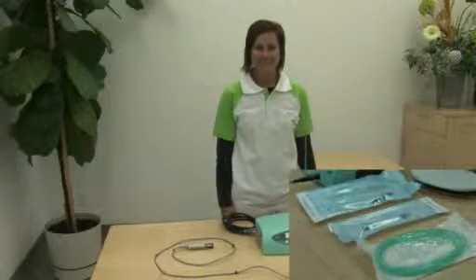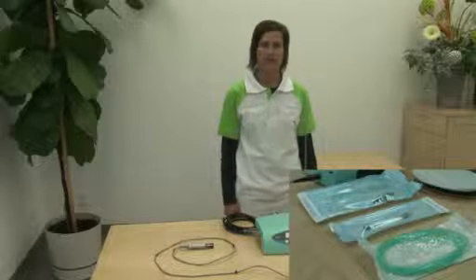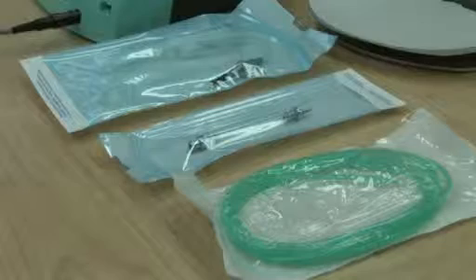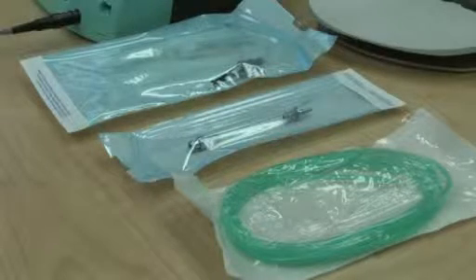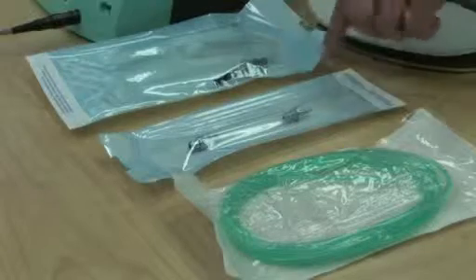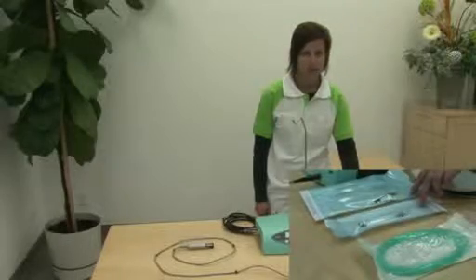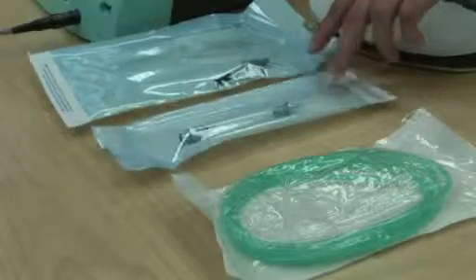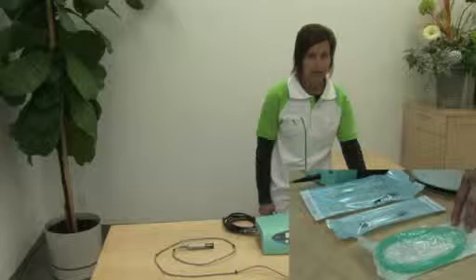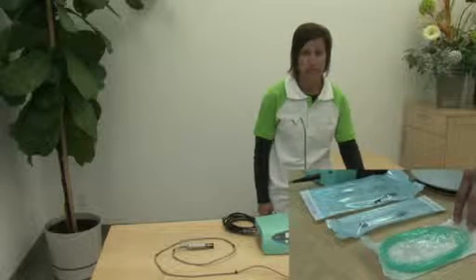Hi, it's Carly with W&H again. In this session I'm going to show you how to install our alternate irrigation tubing system. This system consists of three different components: the spike assembly with roller clamp, the pump tube complete with metal ends, and a disposable tubing which comes in a 10 pack and needs to be discarded after each use.